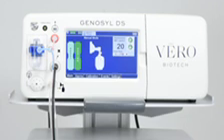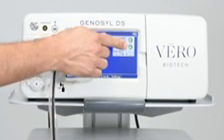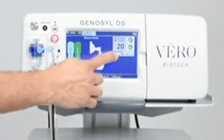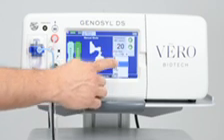The dilution flow rate will default to 10 liters per minute. Ensure this matches the flow through your manual ventilation system. If an adjustment of the nitric oxide concentration is required, press the green up or down arrows. If an adjustment to the dilution flow rate is required, press the LPM value and a drop-down menu will expand.